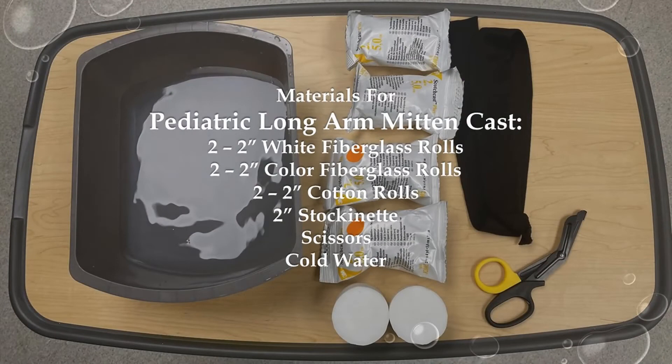Before you begin casting, gather the material that you will need. The amount of material may vary for each patient due to size and age. The materials for a long arm mitten cast are 2 two-inch white fiberglass rolls, 2 two-inch color fiberglass rolls, 2 two-inch cotton rolls, two-inch stockinette, scissors, and cold water.